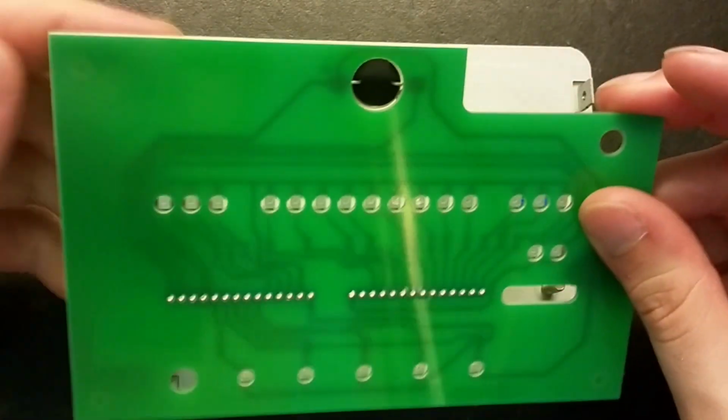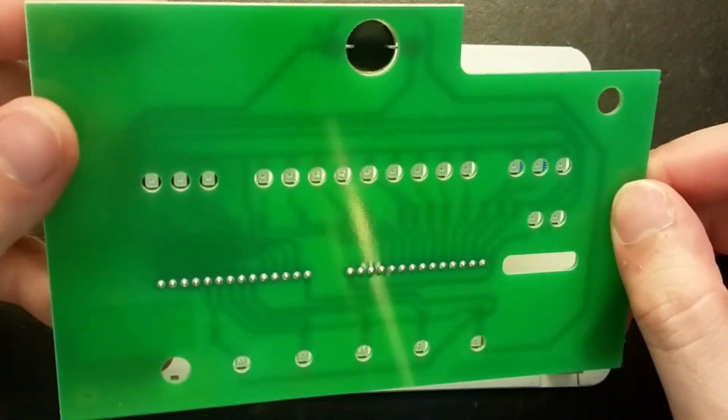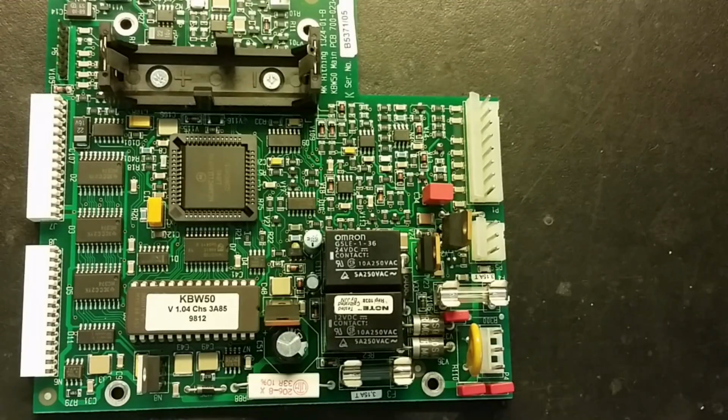That's how I can do it. And the LEDs just light straight through the circuit board. I drilled nice holes for them. Here's the main circuit board. The power comes in here.